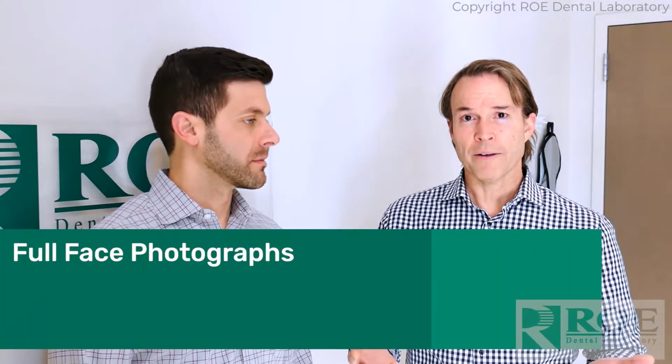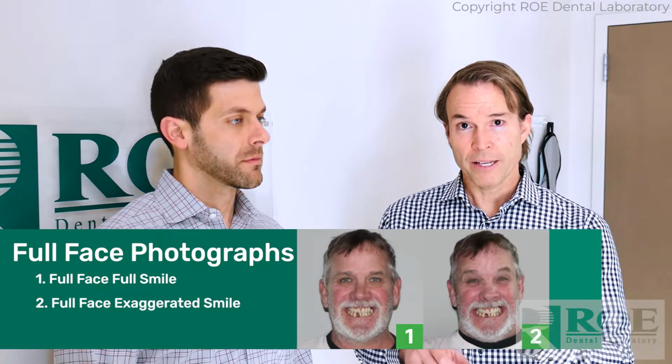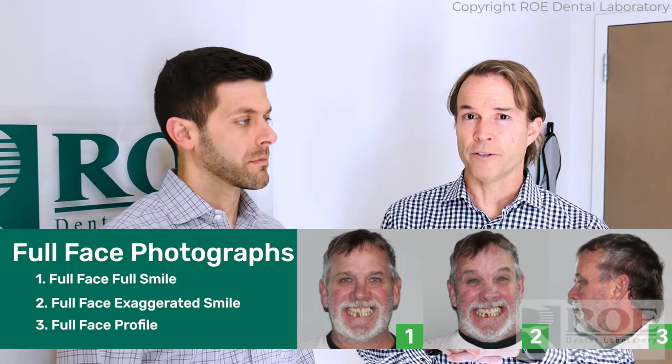So the first series is full face photographs, and we want 3 pictures. One is full face, full smile, full face exaggerated smile, and then a profile picture. Profile pictures are usually for lip support, class 1, class 2, but let's get a profile picture and send it. So one of the first things you want to do is make sure the patient is oriented properly for the photograph. Now, a lot of patients are used to glamour shots, selfies, that kind of thing, so they're often looking up to the right or the left.